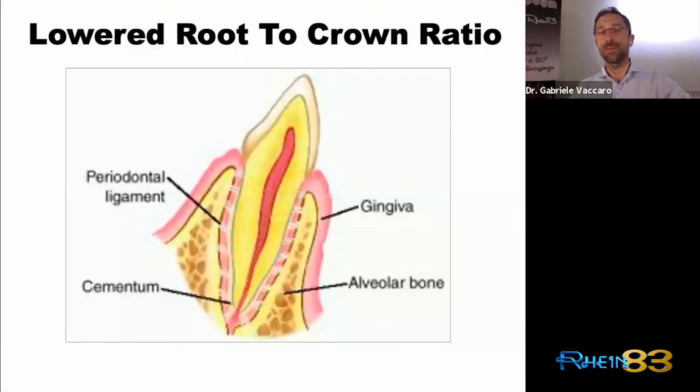Putting a pivot inside a crown instead of a clamp is a big advantage, because we are making a better restoration than a clamp. Since we are cutting down, in that case the crown was cut by the decay, but in many cases we have a residual root and we want to use it, and we cut off the crown on purpose and place the pivot over the residual root.